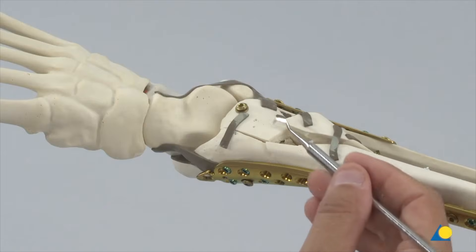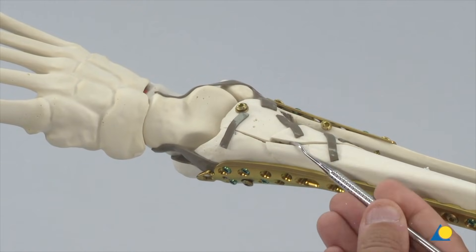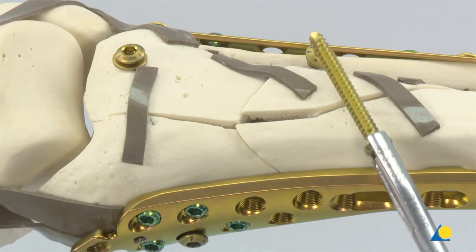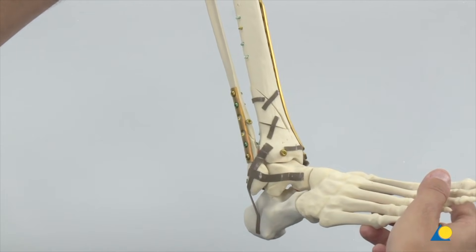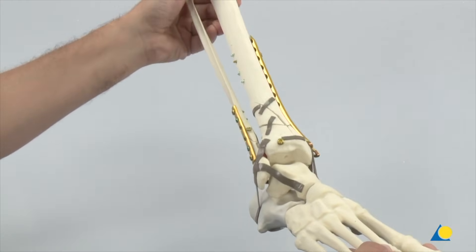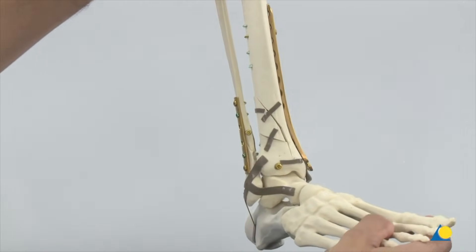If the large lateral fragment is still significantly displaced, it can be reduced, and if needed, a reduction screw can be used to approximate it, though the fragment may not fit anatomically. Here the final alignment of the fibula and tibia can be seen. Observe that the articular surface has now been restored while maintaining alignment of the tibial comminution by bridge plating.